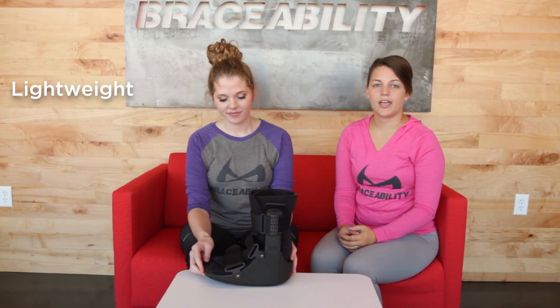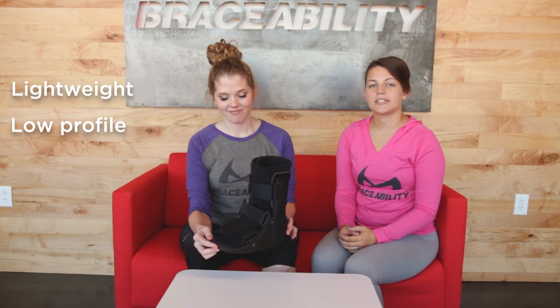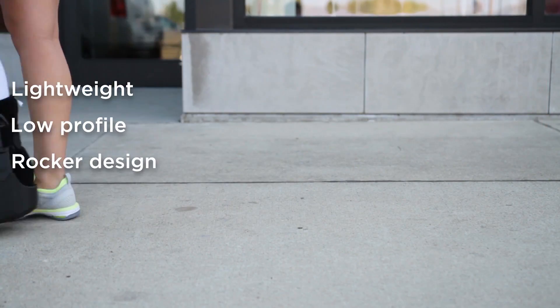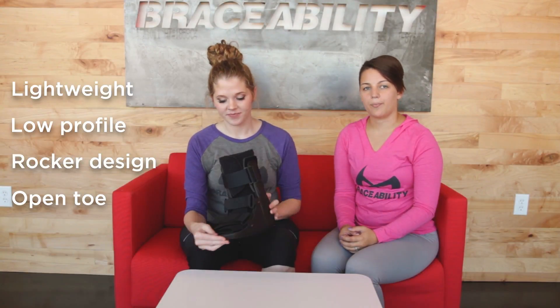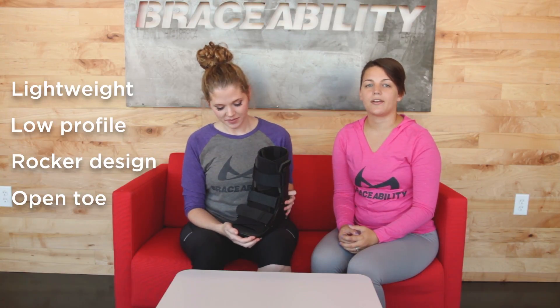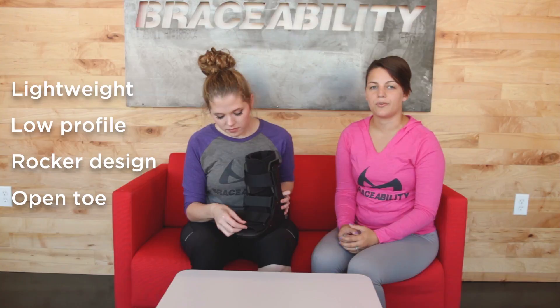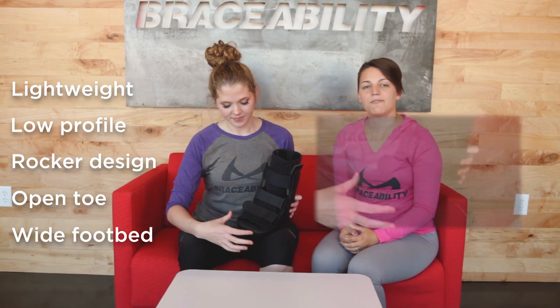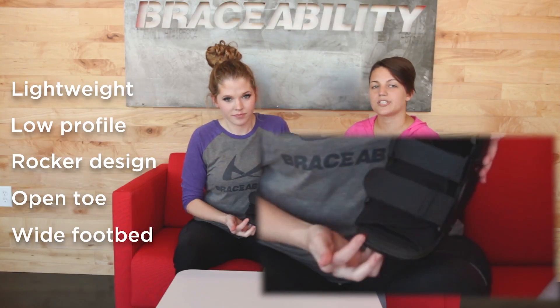This short walking boot was built with an advanced lightweight low profile rocker design, which allows you to step more naturally and smoothly. This boot leaves your toe area open, which is great because it increases the breathability of the boot and prevents any rubbing of your toes against the end of the boot, especially if you have a toe injury. Plus it has a wide footbed allowing for bandaging or swelling.